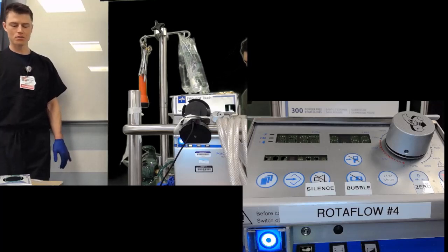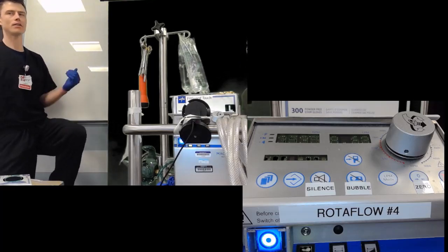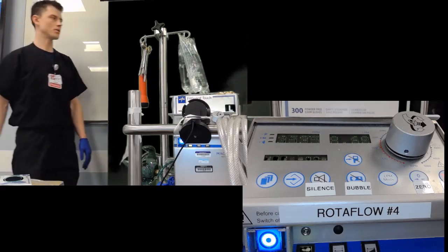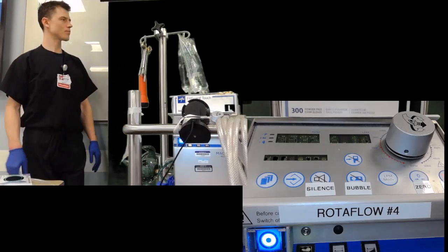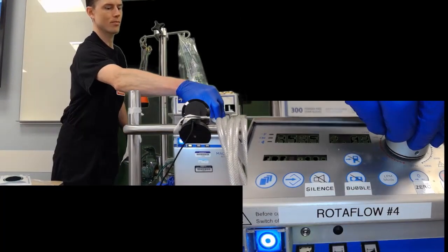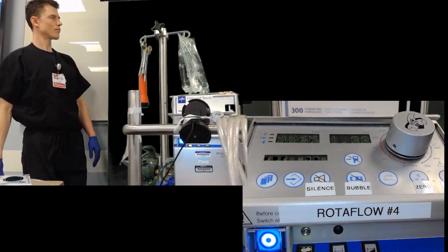That could be external to the patient, or maybe the patient bent their leg and kinked off the cannula inside. So always run your circuit to see what your flow is. Very good. I had a patient, when giving him his bath, when I laid him flat, I completely lost his flow. And we all ran in. We got him naked first. I had a PA and NP, all the nurses were in there.